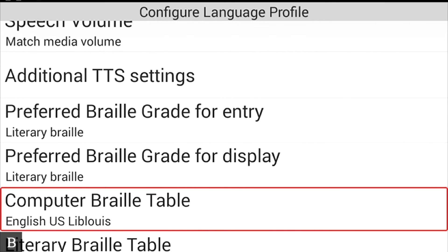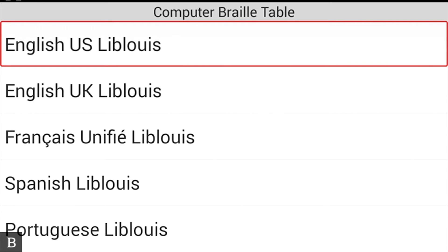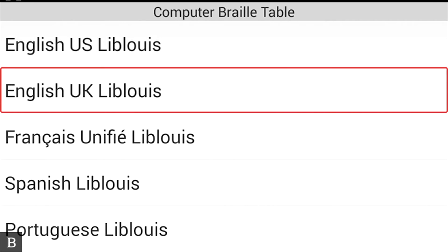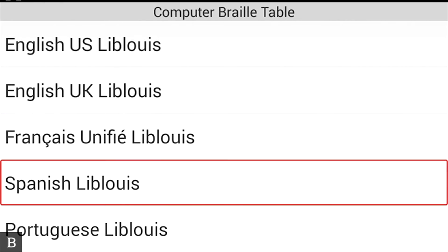The Computer Braille Table is currently set to English US Liblouis. You can choose from many computer Braille table options — for example, English UK Liblouis is also available — covering many different languages and regional variants.